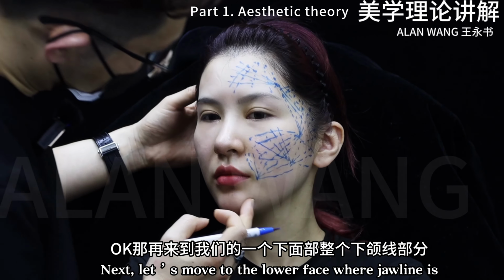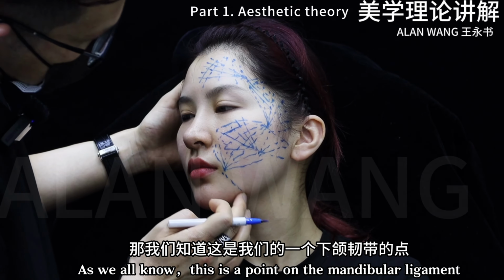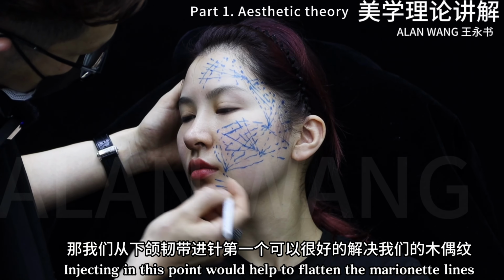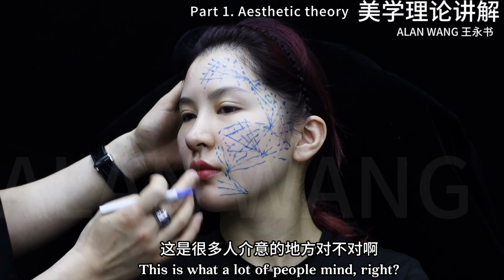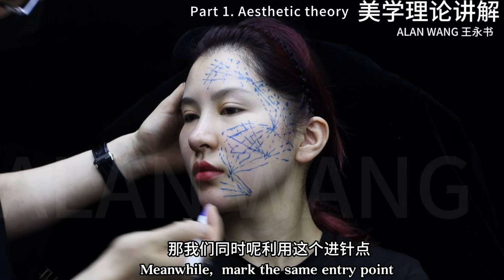Next, let's move to the lower face where the jawline is. As we all know, this is a point on the mandibular ligament. Injecting at this point would help to flatten the marionette lines. This is what a lot of people mind, right? Let's perform a mesh injection here. Meanwhile, mark the same entry point.